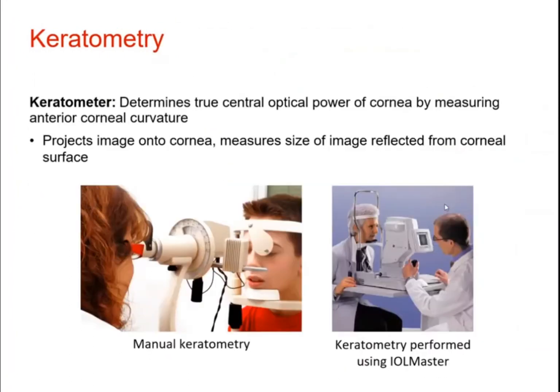So they can measure the central corneal power. There is some difference between the two instruments in the area of measurement.